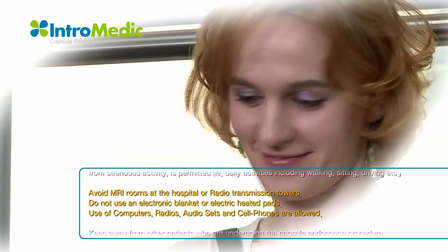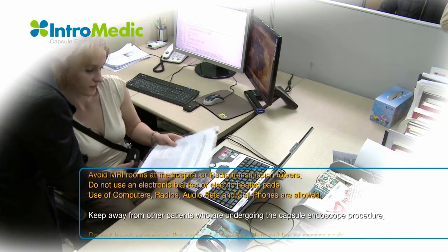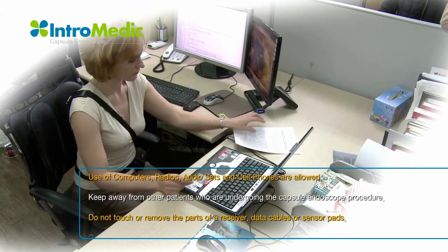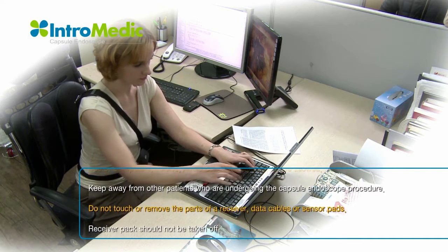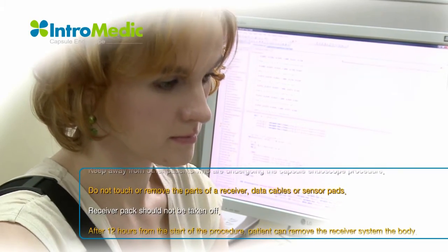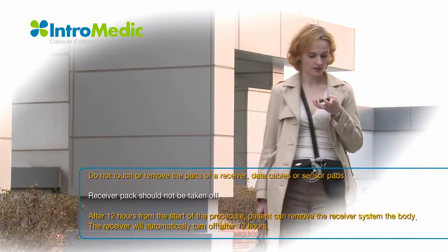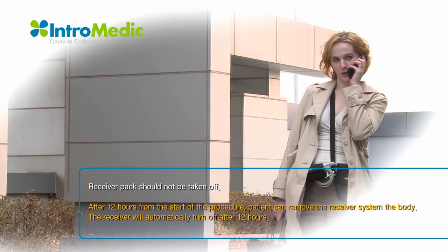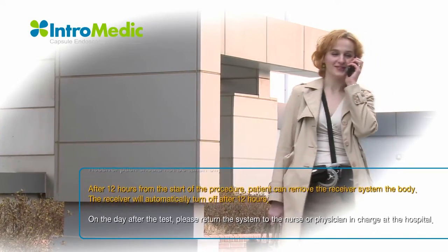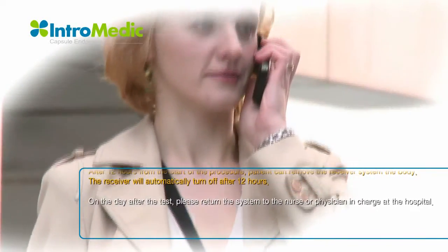Avoid MRI rooms at the hospital. Do not use an electronic blanket or electric heating pads. Use of computers, radios, audio sets, and cell phones are allowed. Do not come in direct contact with other patients who are undergoing the capsule endoscope procedure. Do not touch or remove parts of the receiver, data cables, or sensor pads. The patient may loosen the bag, but the receiver pack should not be taken off. After 12 hours from the start of the procedure, the receiver will turn off automatically and the patient can remove the receiver.